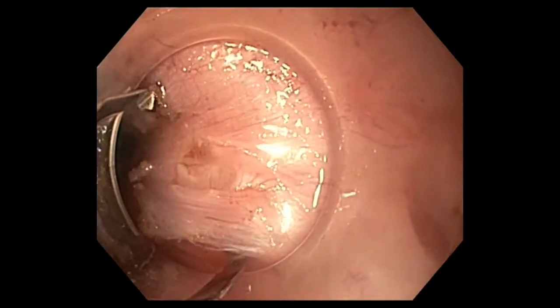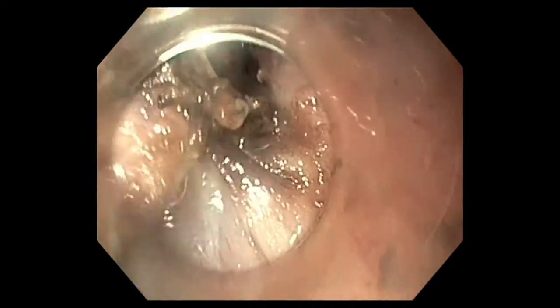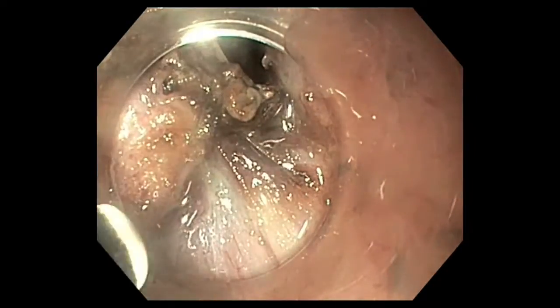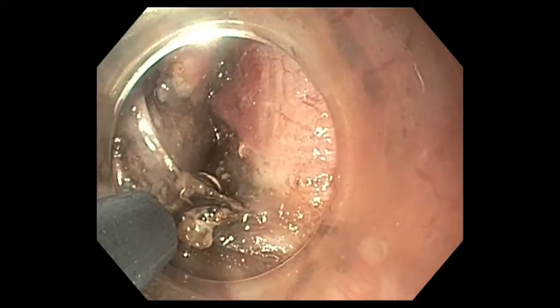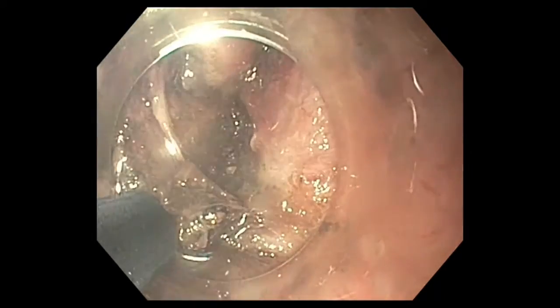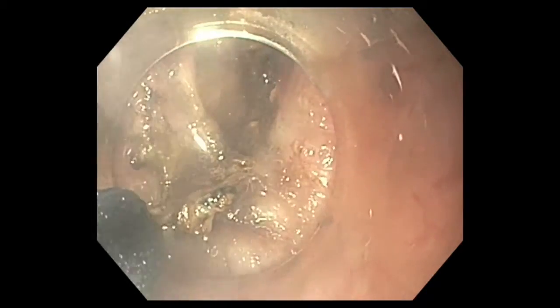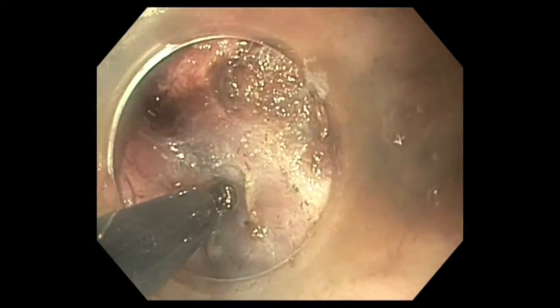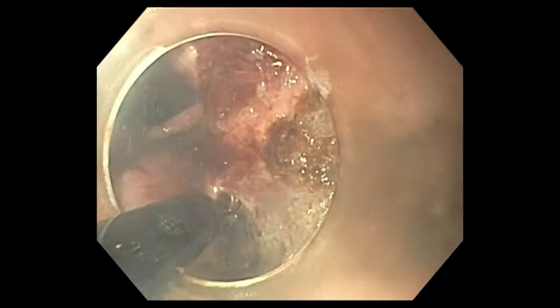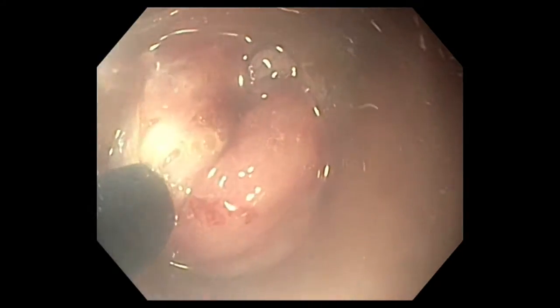An additional tiny perforation was closed with an easy clip. You may have noticed that we switched to an IT knife. This is a blunt tip knife that, when used appropriately, is safer than tip cutting knives in areas with poorer visualization, perpendicular axis, or presence of larger vessels. The decision to change knife in the middle of the procedure accelerated the dissection and solved the problem of difficult axis.